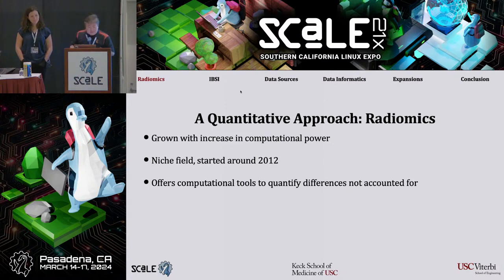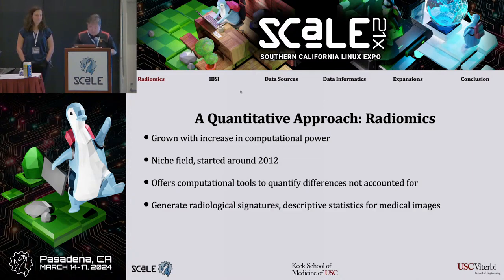And then, one of the issues is that there's a lot of these tools that are being developed, and we're trying to assess how to use these tools. Because the entire idea is how do we turn these images that are digital data and try to extract metrics that are quantitative and then also useful. Just because it's quantitative doesn't mean it's useful. So we're looking at that.